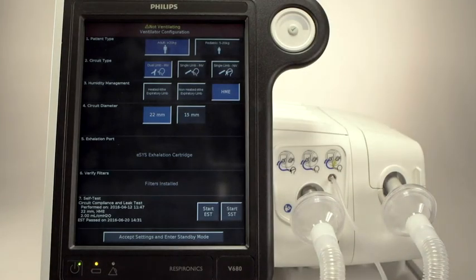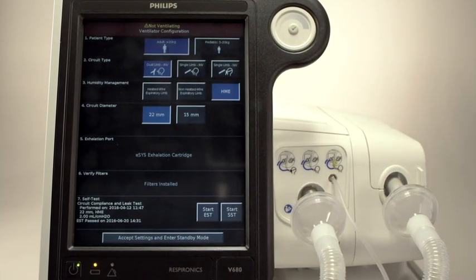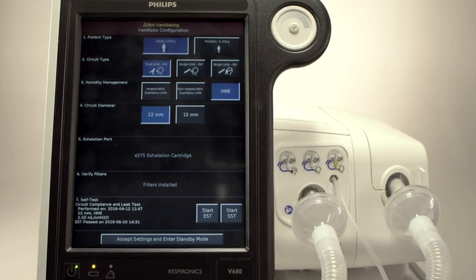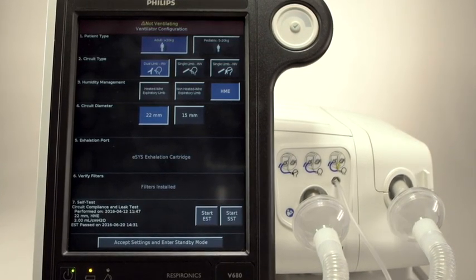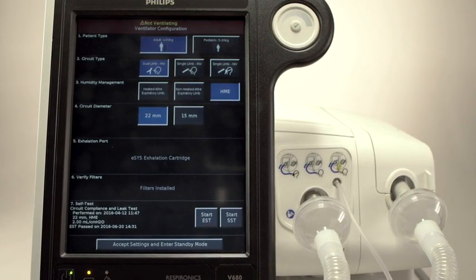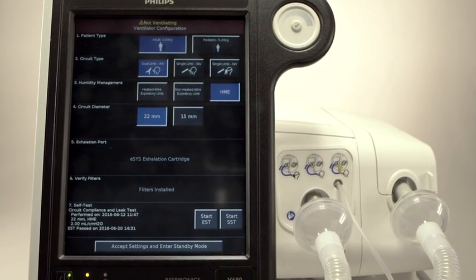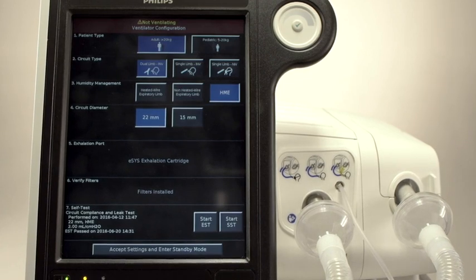Both tests should be run before placing the ventilator on a new patient. The short version tests for leaks and measures circuit compliance. It also tests the function of a remote alarm if connected. The long version will calibrate the O2 sensor and test various hardware, safety systems, and alarms.